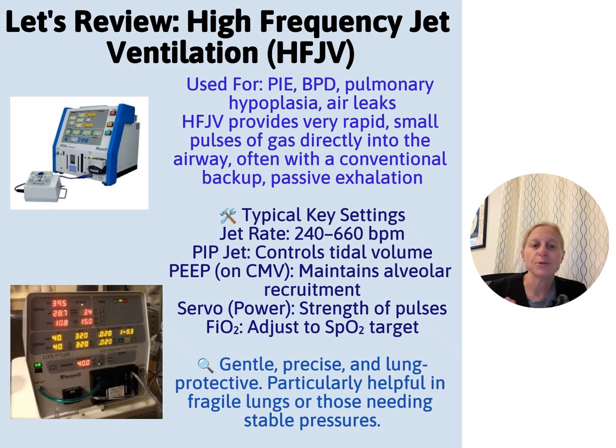So this is gentle, precise, lung protective. We often use this as a way to reduce our risk of IVH, because we're not getting big changes in our lungs, which can impede blood flow around the body and cause rushing of blood. With gentle ventilation, we can also often prevent major swings in our CO2. And so you will see the jet used very often in small baby protocols, small baby units, etc.